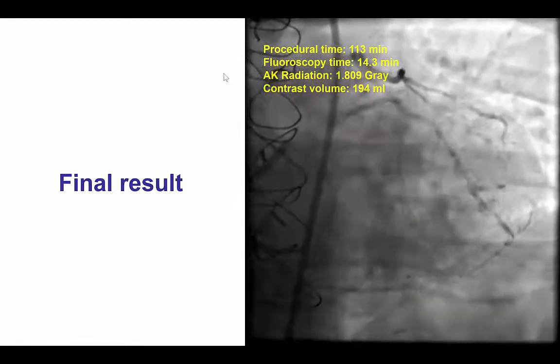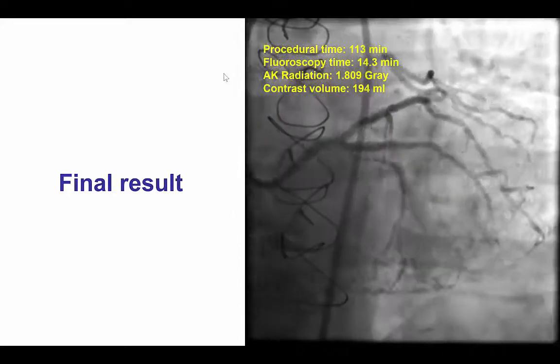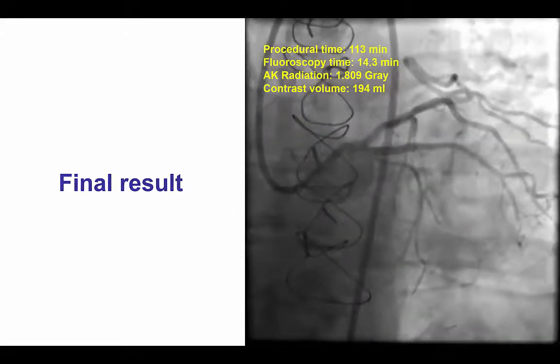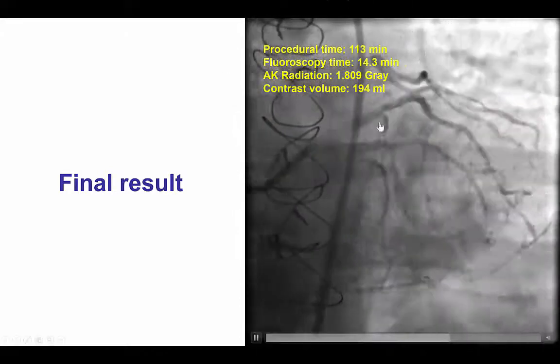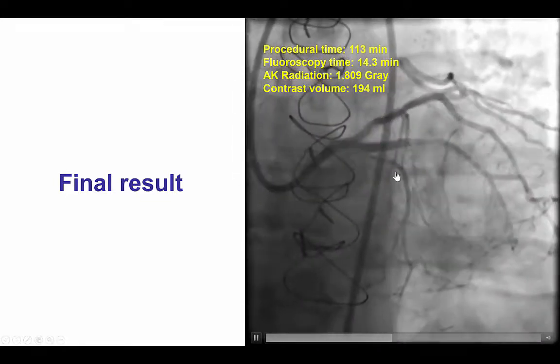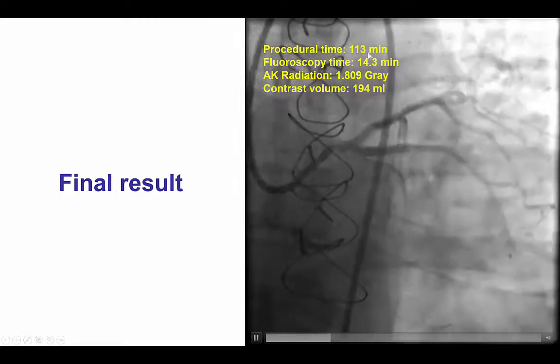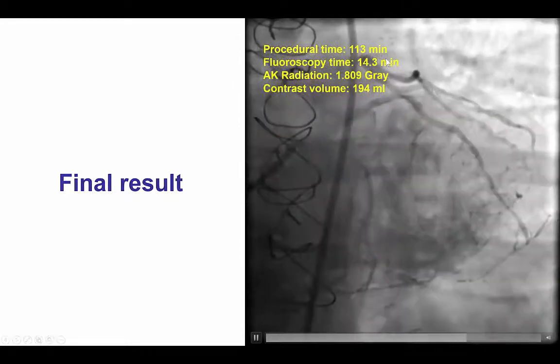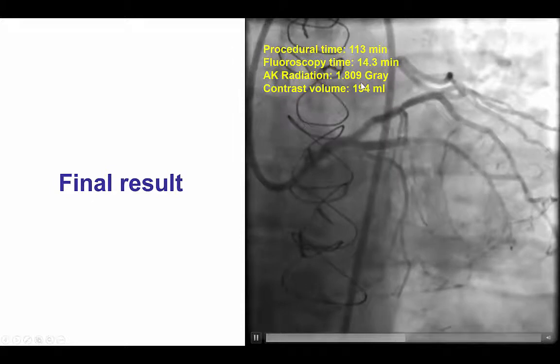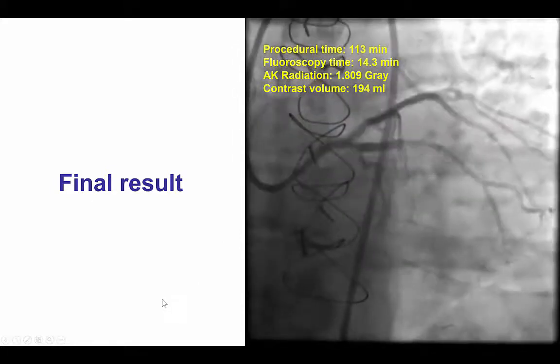After doing that, there was no need to do any balloon dilatations in the distal circumflex, and that was an excellent result with TIMI flow into this large obtuse marginal branch, but preserved flow into the distal circumflex as well. Less than two hours procedure time, 14 minutes of fluoro time, 1.8 gray air kerma radiation dose, and 194 mL of contrast.